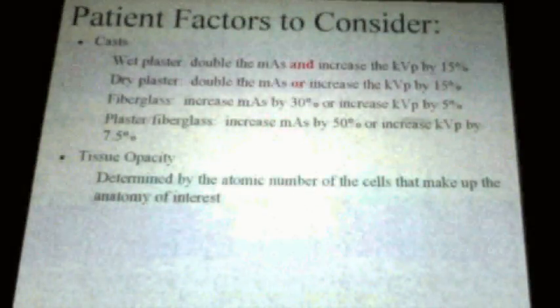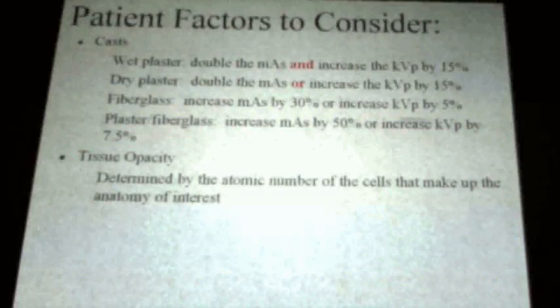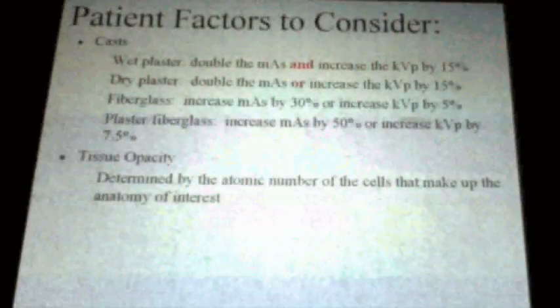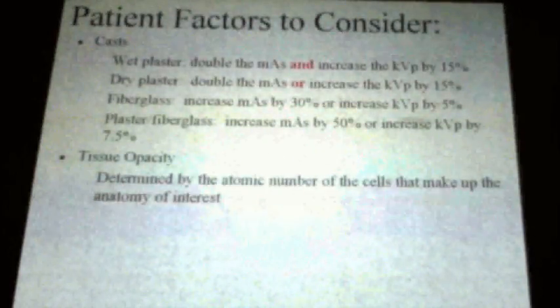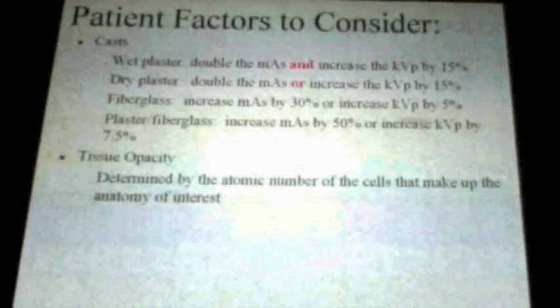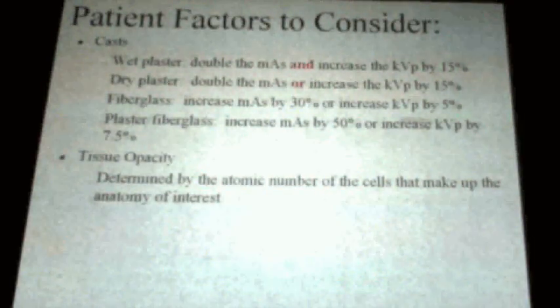It'd be clear. Does it still come up in the image? You just don't notice it because the table's bigger than the image area? No? Because the table's made out of something that doesn't absorb the primary beam? It does though. Anything solid will absorb the primary beam, it will attenuate it.